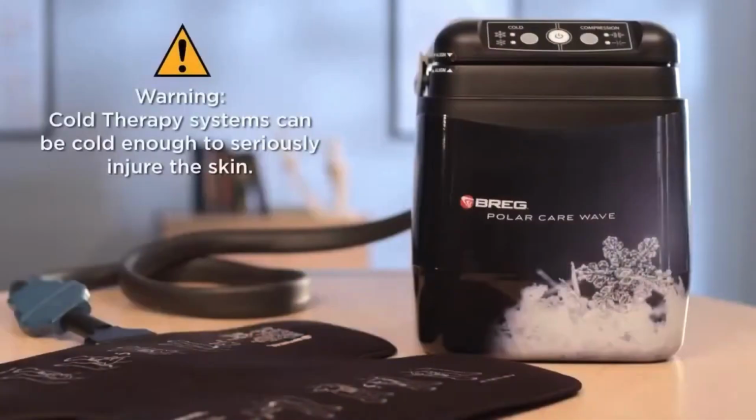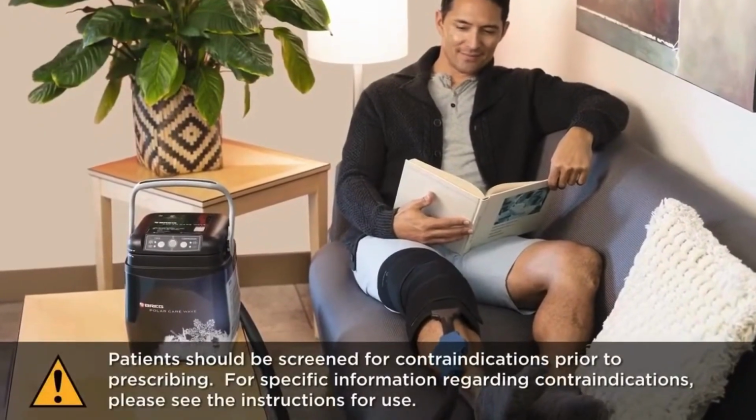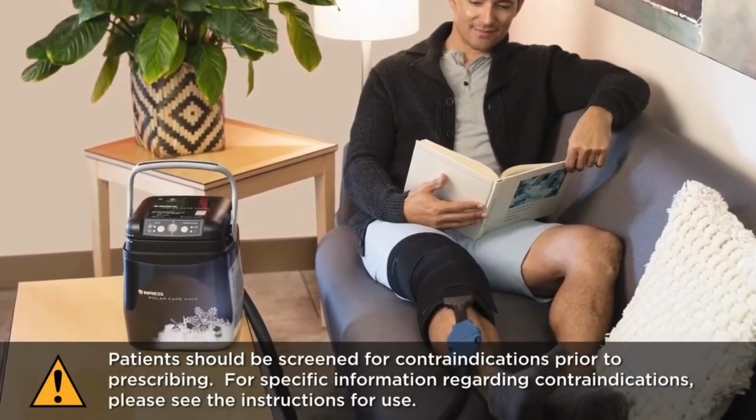A word of caution, Polar Care systems can be cold enough to cause serious injury, including full skin necrosis. Be sure to follow these instructions carefully. Certain medical conditions make cold-induced and compression injury more likely.